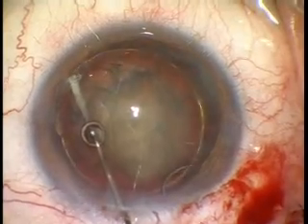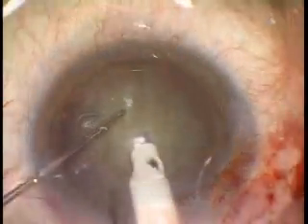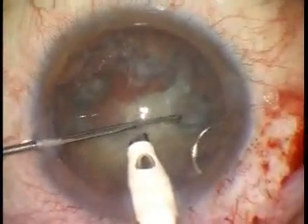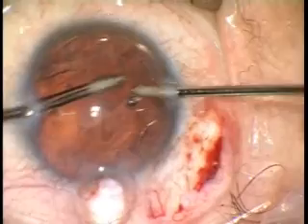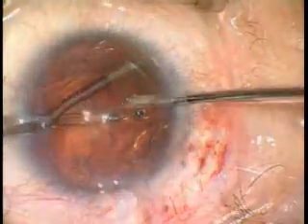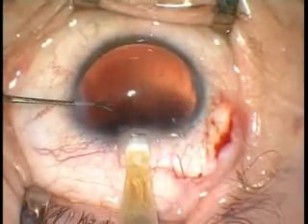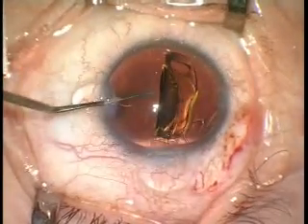Hydrodissection is performed in order to separate the lens material from the capsule. The standard chopping or any other phacoemulsification technique is used depending on the lens nucleus hardness. The ring provides support to the capsular bag; at the same time, it makes the removal of cortical material from the capsular bag more difficult. Insertion of the foldable IOL is easily performed with the device in place.